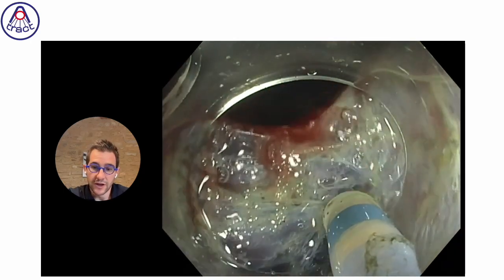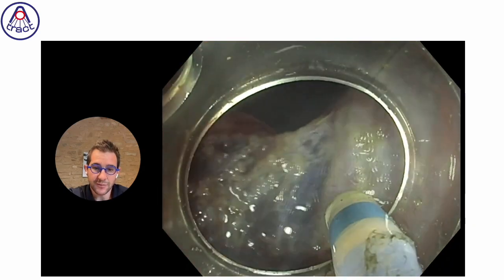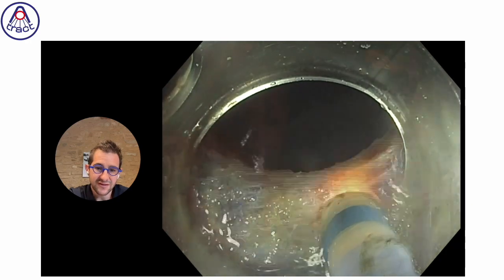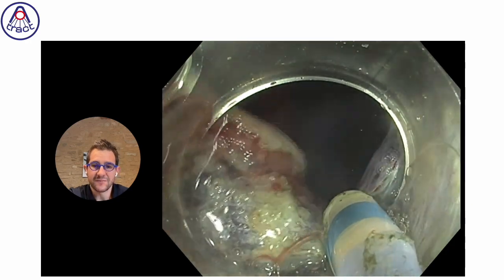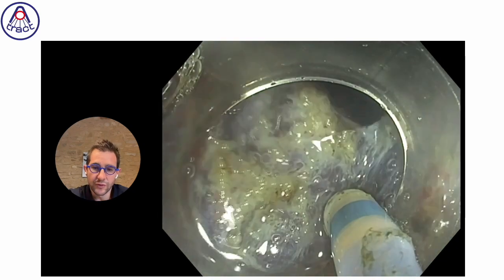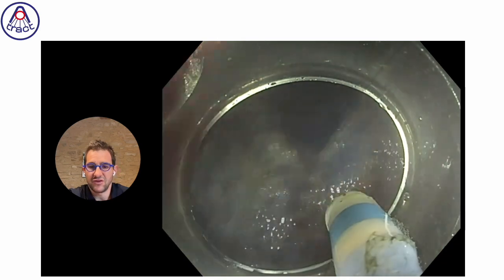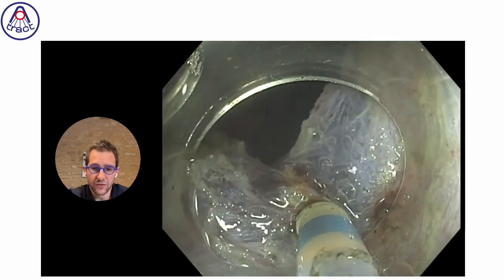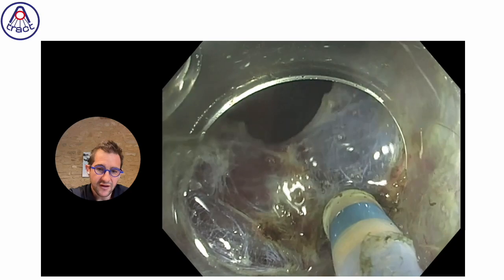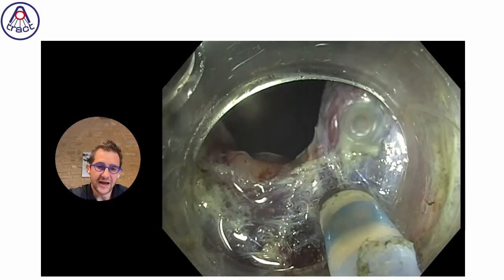So here we go, doing always the same lines, which is an important point, I think. It's less difficult for your brain to repeat always the same cutting line. You are less tired if you repeat always the same thing than if you should think every time which line you should do.